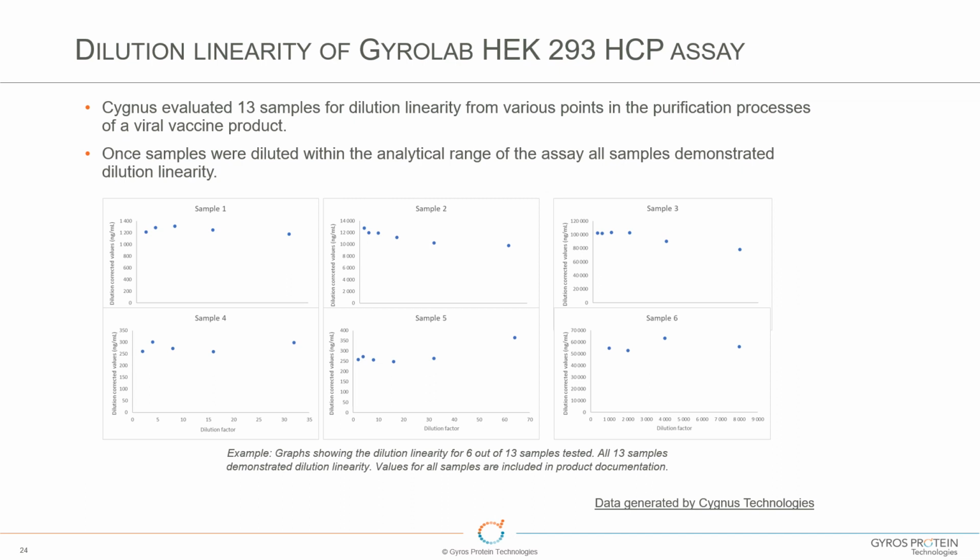Yeah, I think when you have a method that's semi-quantitative like this, it's really critical to show that within-sample dilution looks good. Sometimes they'll even spike in standard to make sure that you're getting dilution linearity. Yeah, they do both. So you do spikes.